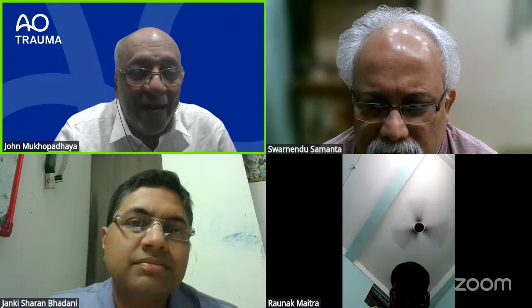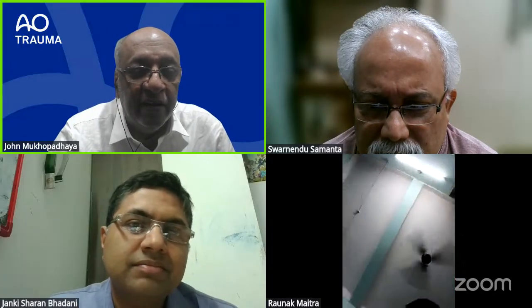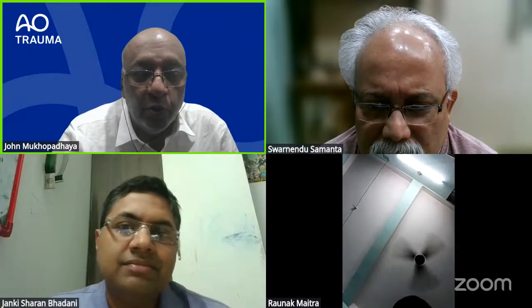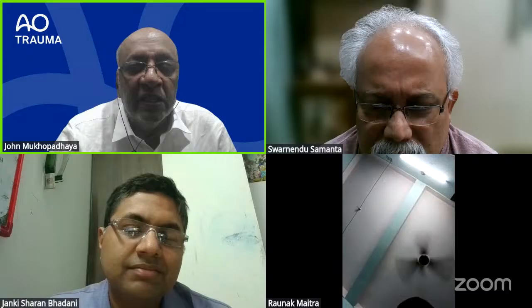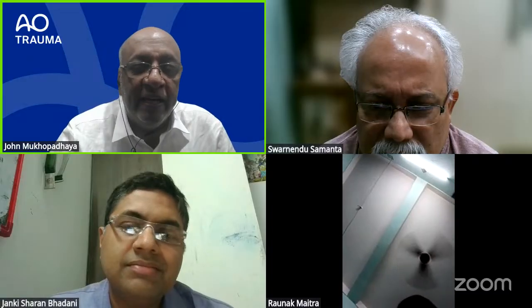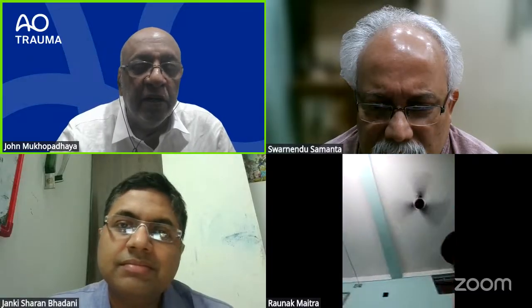Describe the findings that you see and only then talk about the diagnosis, and generally wait for the examiner to ask you the diagnosis. So you give all your descriptions and then you can say, I think this is most likely such and such, but usually by then the examiner will ask you, okay, what do you think is the diagnosis?